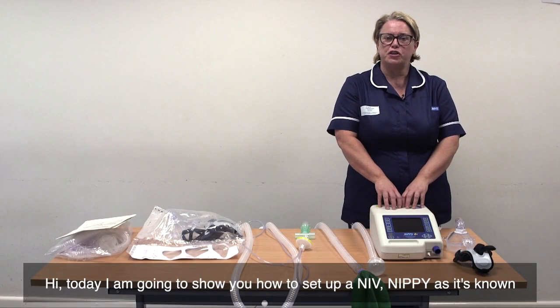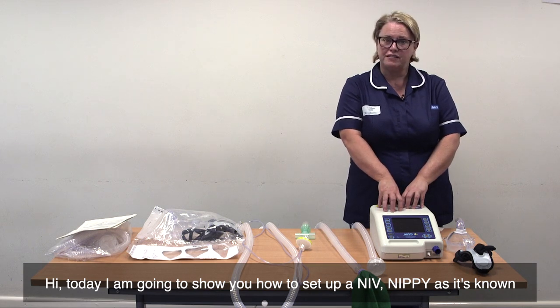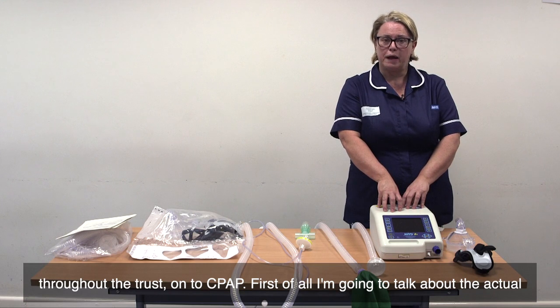Hi, today I'm going to show you how to set up an NIV, NIPPY as it's known throughout the trust, onto CPAP.